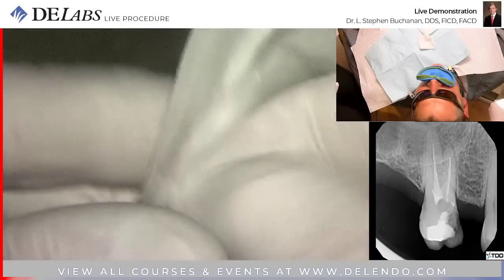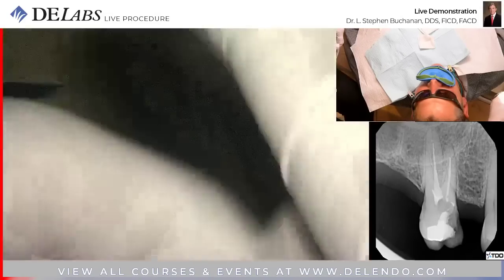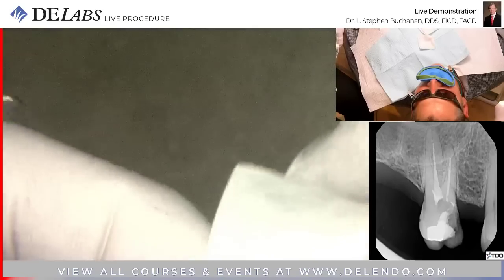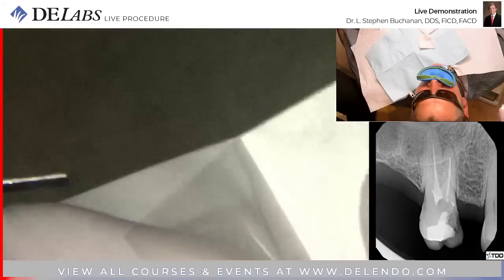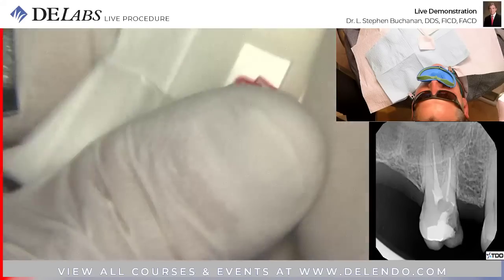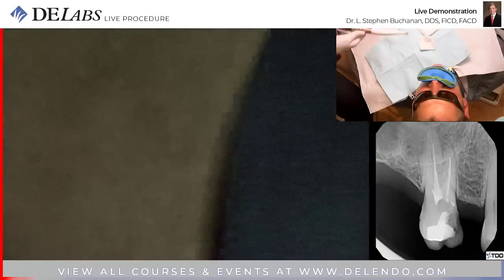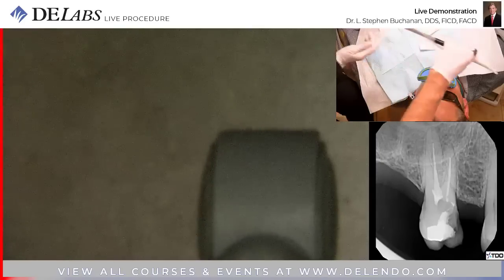Okay, number 8, this is the ceiling cap. So the ceiling cap changes height to match the pulp chamber height. Because with the molar attachment, we're going to put the active element inside the pulp chamber. The active element is the part that resonates. That's this part right here.